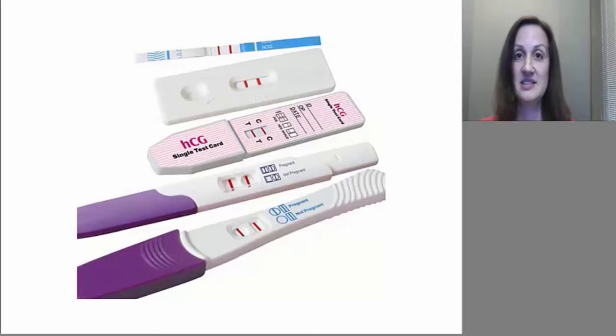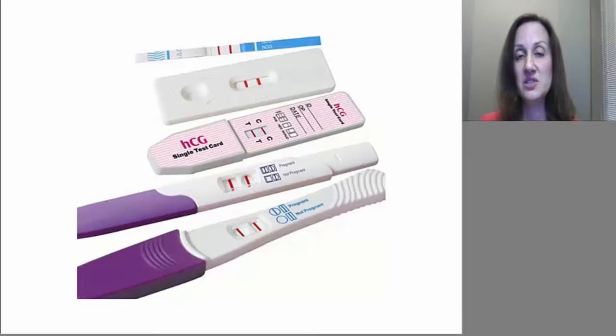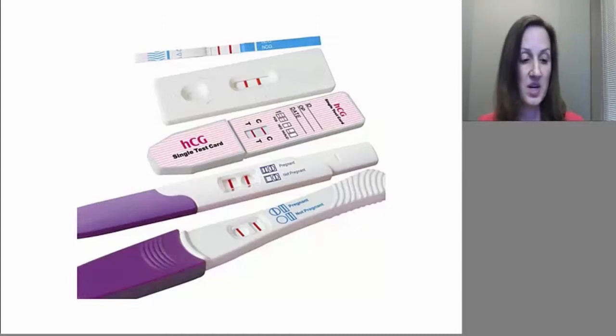These are strip tests that detect HCG protein in the urine of pregnant women. The good thing about this test is that the longer a woman is pregnant, the more of this protein is in her urine. So the test becomes more sensitive over time as the pregnancy progresses. There's a very high amount of this protein in the urine, so it's a very easy test to do, and to do cheaply and to distribute widely. What I argue is that we can use some of the same techniques used in these devices and also some of the lessons we've learned from using these devices to make simple devices for molecular diagnoses, for diagnoses of diseases and conditions that require the detection and analysis of nucleic acid targets available to people worldwide.